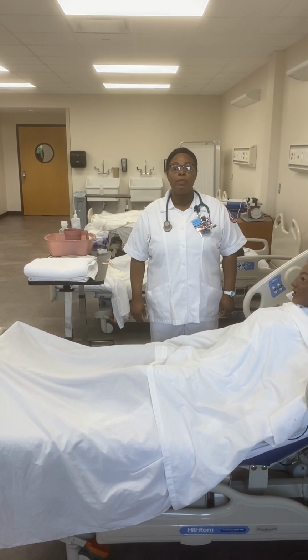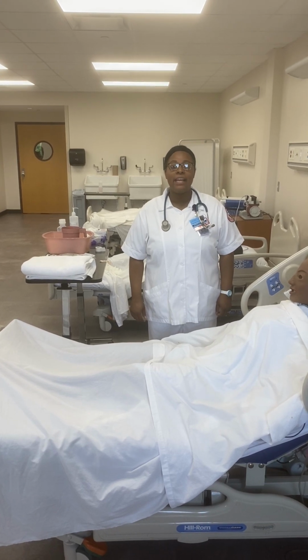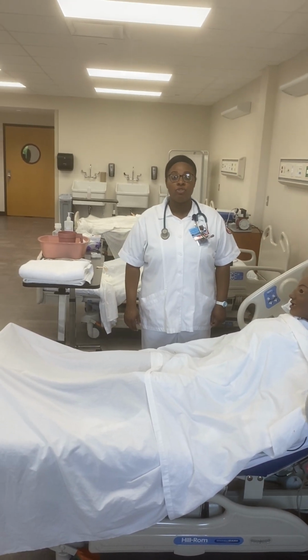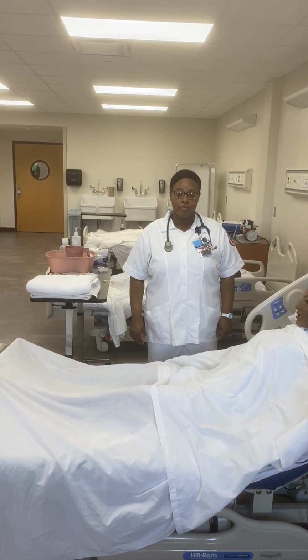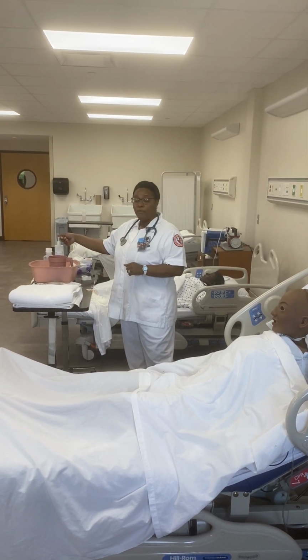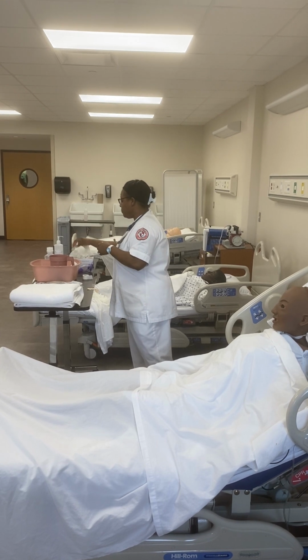In this video, I'll be demonstrating NG tube insertion, enteral feeding, and NG tube removal. NG tubes can be used for medication administration, bowel obstruction, ileus, nutrition, or if a patient is NPO. At the start of this procedure, I will verify my physician's orders and identify my patient. I'm going to perform hand hygiene and don clean gloves.